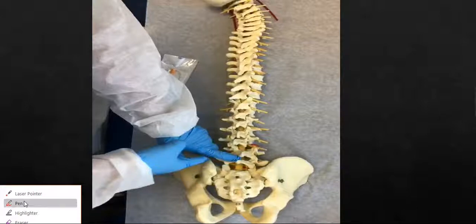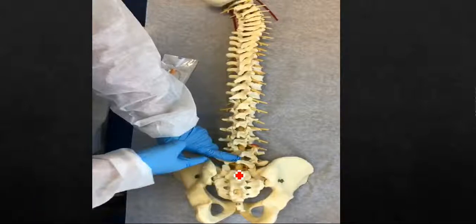Why is that so important? That's really important because when you palpate that, you know that this is S1. This is the first step for you to be able to localize the entry point where you're going to go with your needle through.